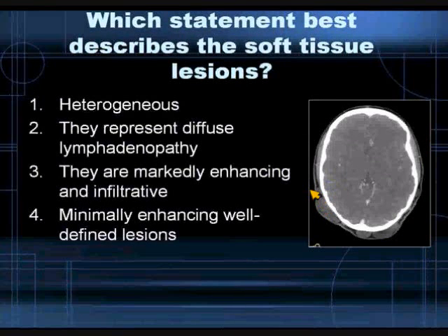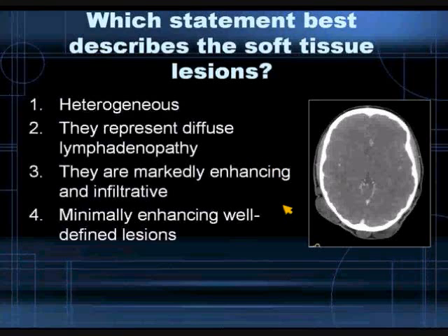Next question: Which statement best describes the soft tissue lesions — the soft tissue masses the patient has? Do you feel that they're heterogeneous? They represent diffuse lymphadenopathy? They are markedly enhancing and infiltrative masses? Or they are minimally enhancing well-defined masses? Please enter your choice.